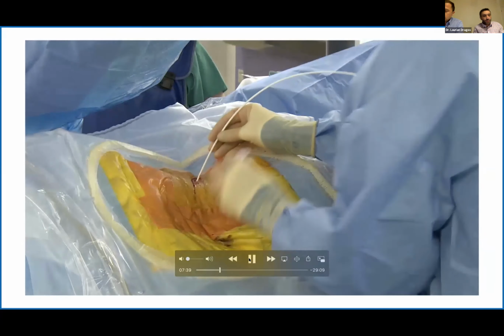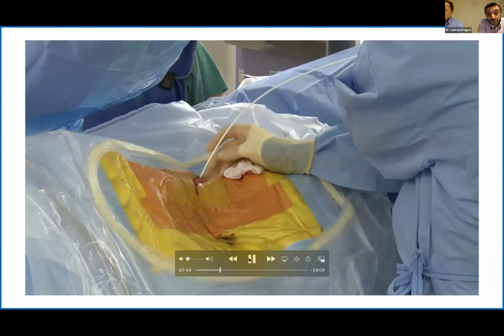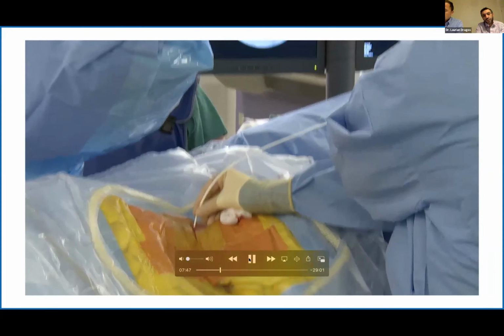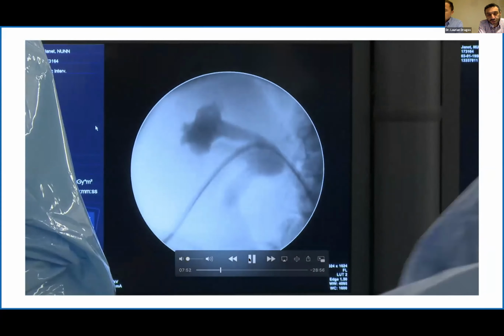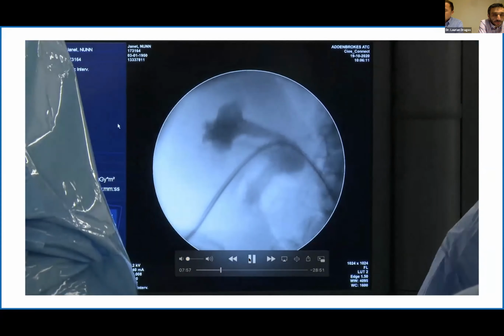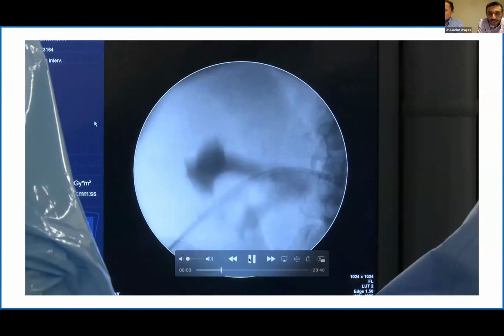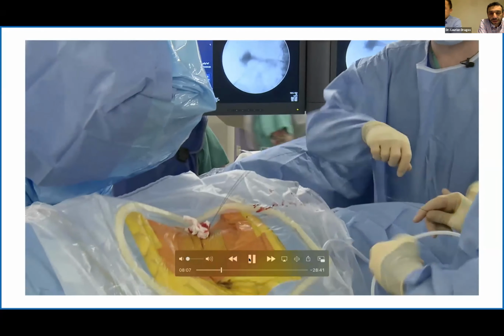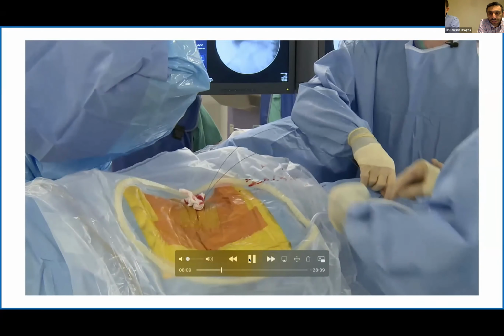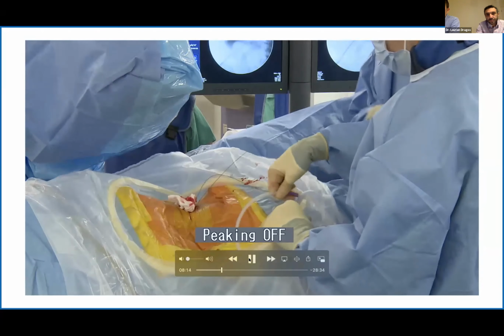We tend to use Nephromax dilators, and in this setting we use the 24 French dilation. We used to do 30, we've gone down to 24 purely because of the larger stone burden. But depending on the stone burden and expertise, other people may use a smaller tract size. Some of the things that we can discuss later on is what you do at the end of the procedure in terms of whether you do a tubeless PCNL, whether you do it with nephrostomy or with stents.